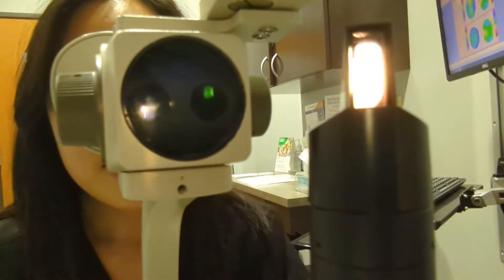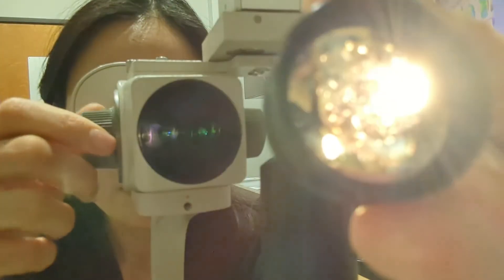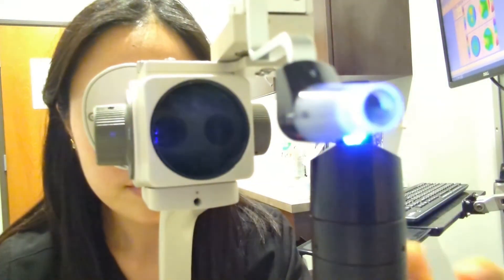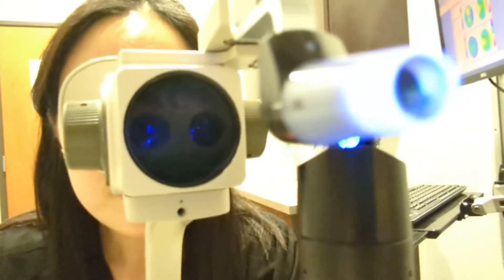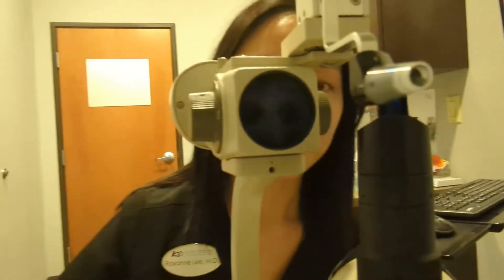Alright, let's take a look on the inside of the eye — just look at my ear. Your eyes look very healthy. I don't see any damage to your retina from the diabetes. I do recommend still getting a yearly eye exam to make sure nothing changes. You do have a cataract forming in both eyes — it's just a natural age-related progression. If you're having any issues with your vision, like blurry vision despite wearing your glasses or glare at night, then that's the time we get to start talking about cataracts. Okay, let's start talking about your options.